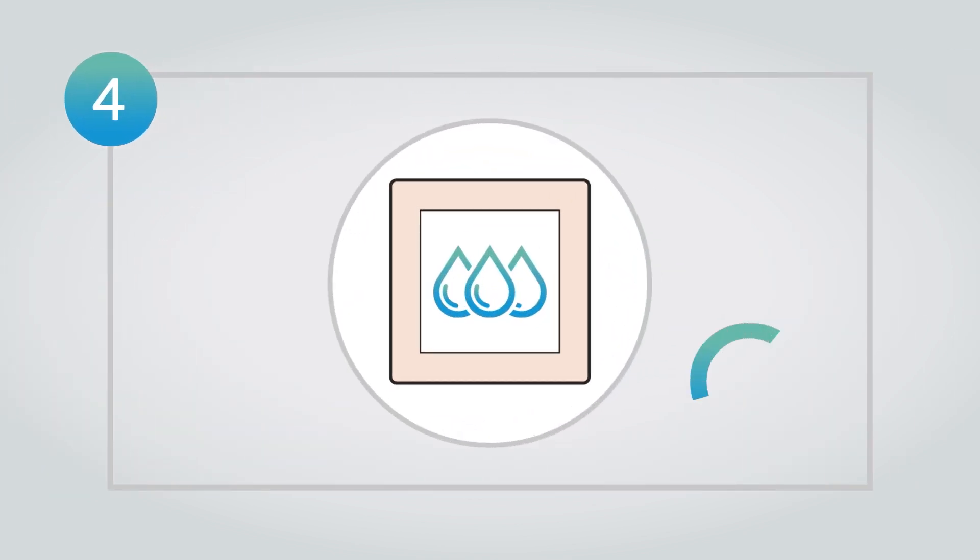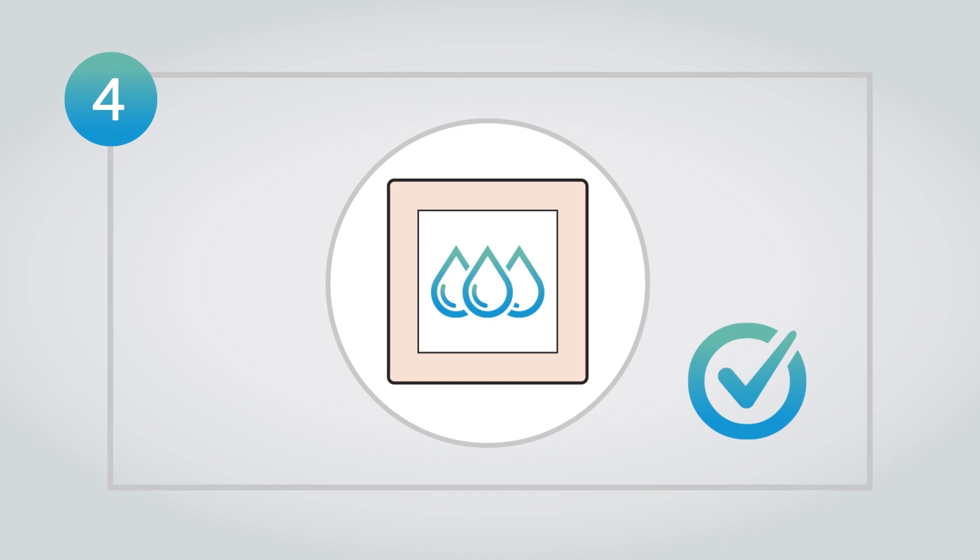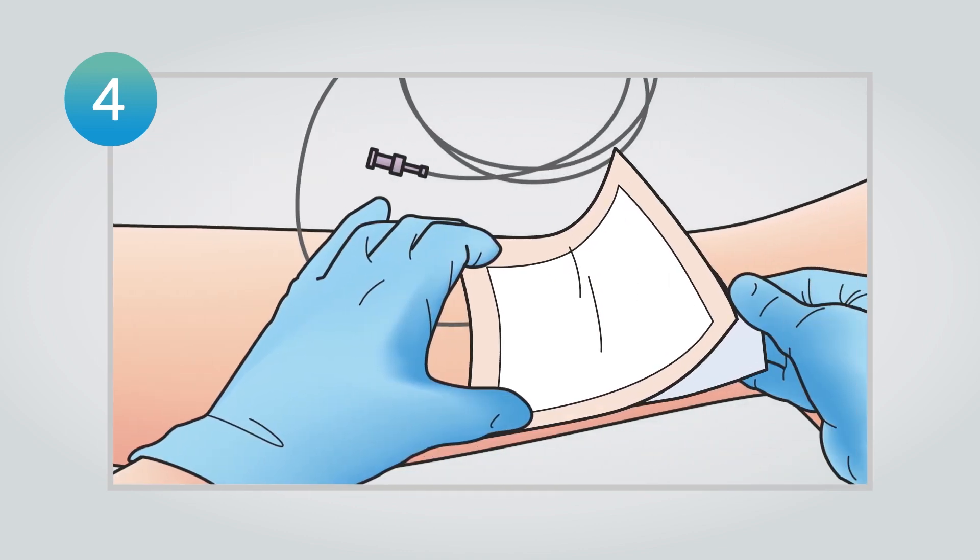Cover the ODS with a suitable absorbent dressing. It is important to seal around the dressing to capture the oxygen produced underneath.